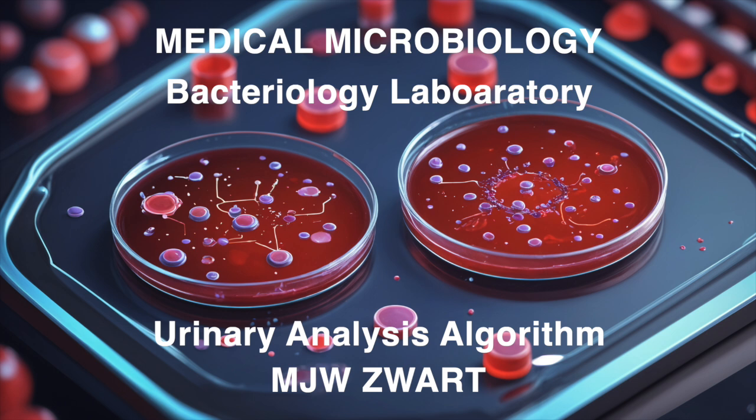Precisely. And they also recommend including comments about possible contamination. Based on those initial findings from the Q-score and gram stain. Interesting. This can help clinicians interpret the results in context and make informed decisions. It's like providing a complete picture. It is. Not just a snapshot. Exactly. I like that. It feels very patient-centered.